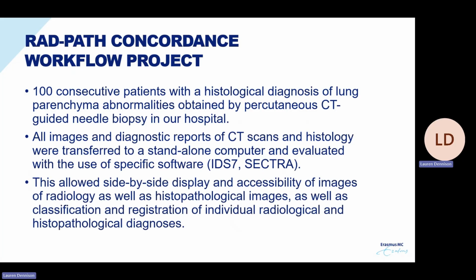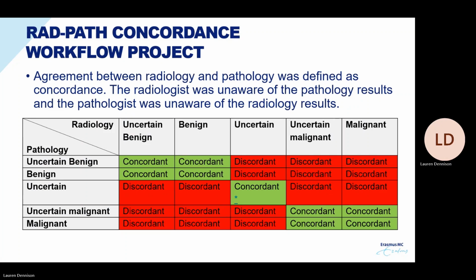And this allowed then side-by-side display and accessibility of images of radiology and histology, as well as our reports, so the classification and the registration by us, so by me as a pathologist and also by the radiologist, when it comes to the estimate of the malignancy or potentially benign nature of these lesions.